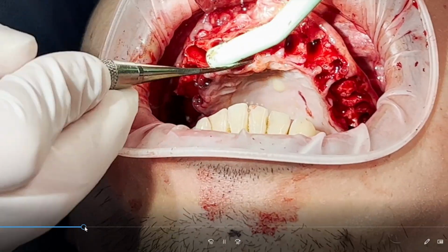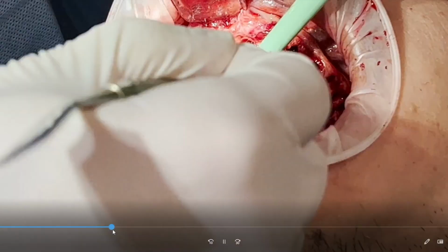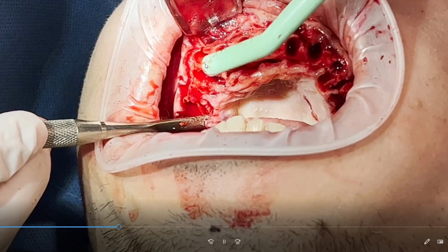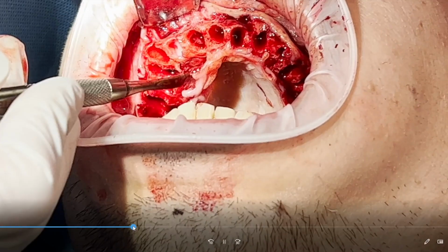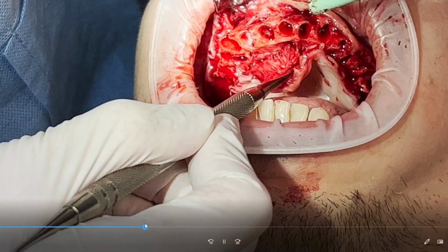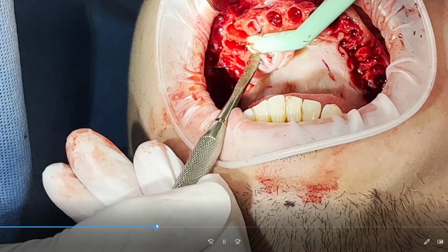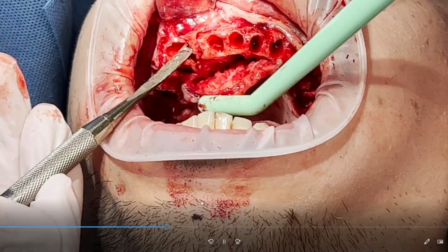As we keep flapping, separating the gums, that's what we gotta do for every all-on-4 procedure. So what ends up happening here? Because so much of that structure was undermined due to that huge infection and bone loss, you're gonna start to see the bone starting to crack off, because with all this pressure and undermining of the bone, you're gonna start seeing the fracturing. So the bone is literally gonna start breaking off. All right, here we go. Yep, I think there we go. You start seeing it fracture off, right?